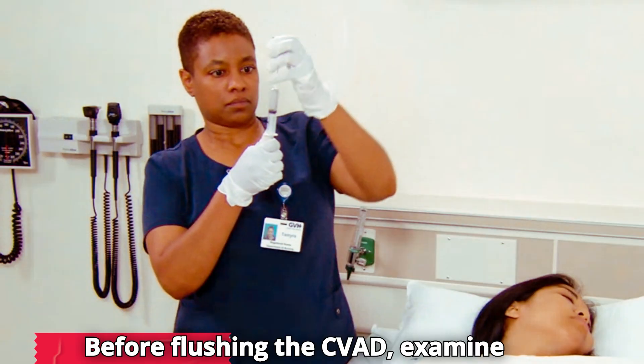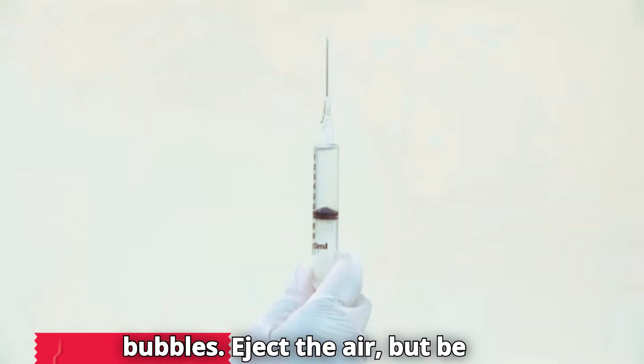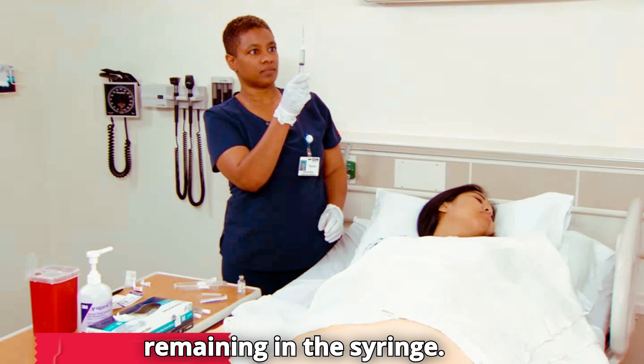Before flushing the CVAD, examine the syringe and flick it to remove any bubbles. Eject the air, but be sure you have enough flush solution remaining in the syringe.